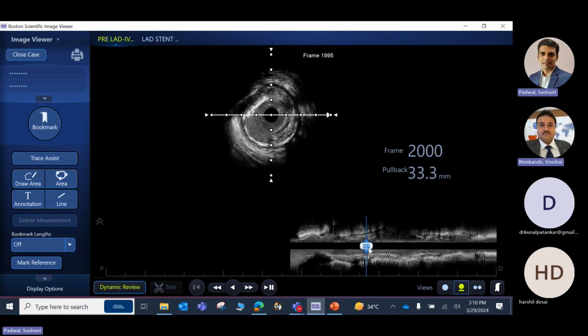So I hope all of you have made arrangements for that. You all have the Windows laptop, right? Yes, I don't, but I'll manage someone. Okay, because this software, the IVUS system, is only Windows based. So everything we can do offline is a Windows based system.